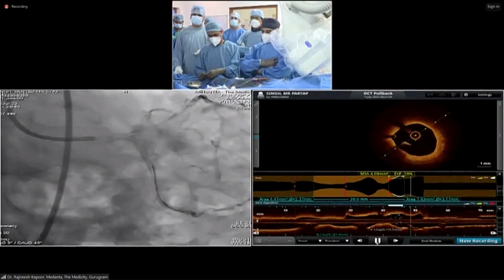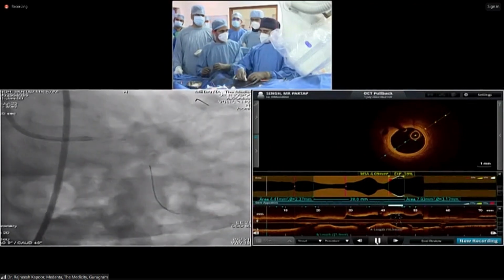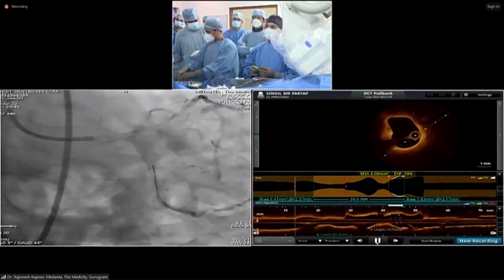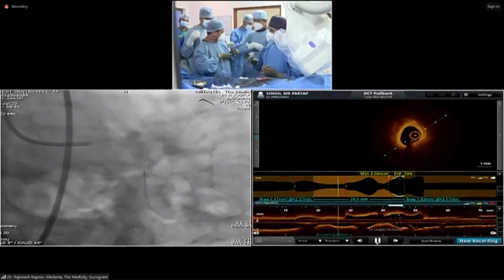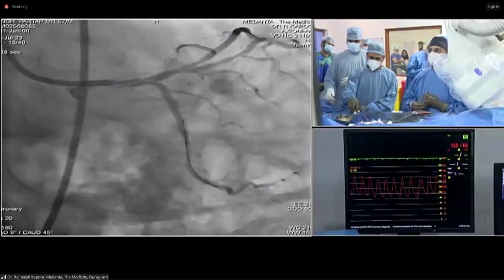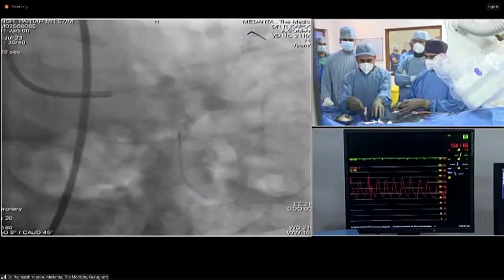So now, next steps. I think let's take the stent. Any inputs, please give us your thoughts, it's very important. Yeah, the crossing becomes very important in the type of technique you're using. If it is a DK crush, it's always recommended that you go from the proximal strut rather than the distal strut, because distal struts means again you are going to distort the stent.